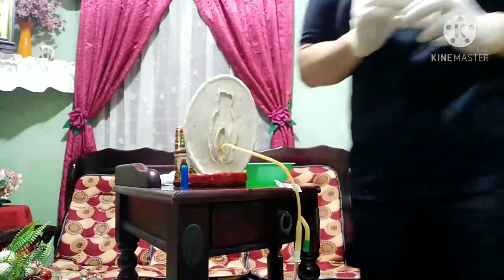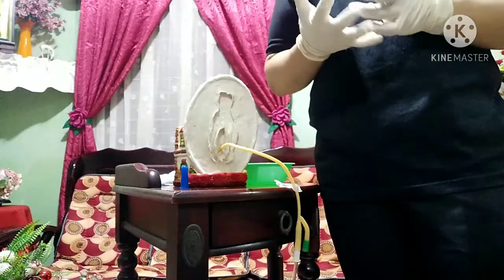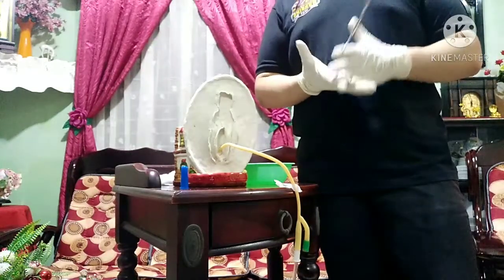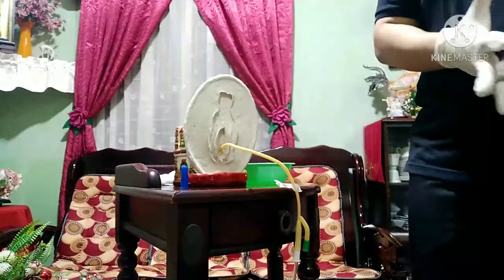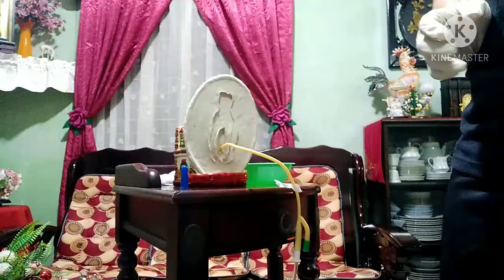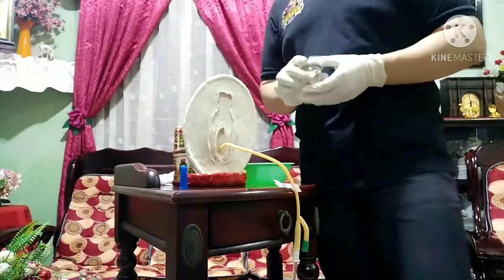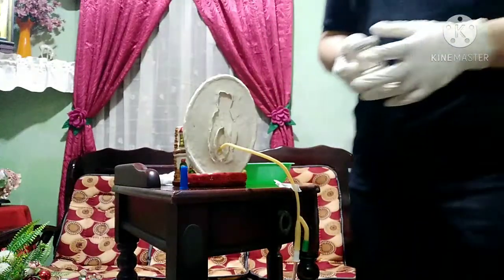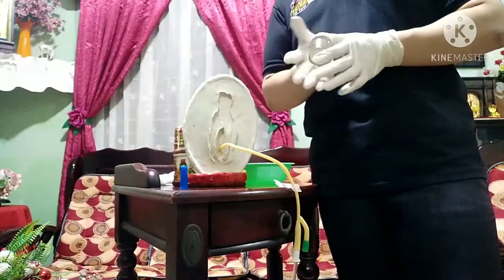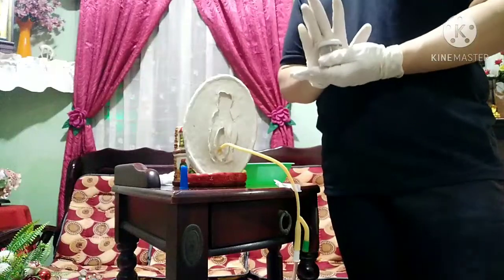Ganun po. So, step 25 measures the urine output, notes the color, character, and consistency of urine po. So, i-measure po natin yung urine output po, i-note natin kung ano pong kulay ng urine, and yung consistency niya po. So, step 26 is send the urine specimen to the laboratory with proper label. So, ito pong urine na nakolekta po natin, isi-send po natin sa laboratory, and lalagyan po natin ng label kung ano pong pangalan ng patient, kung anong date po kinuha. Yung mga classic info po. And then, ayusin po natin siya na mabuti para hindi po siya matapon.